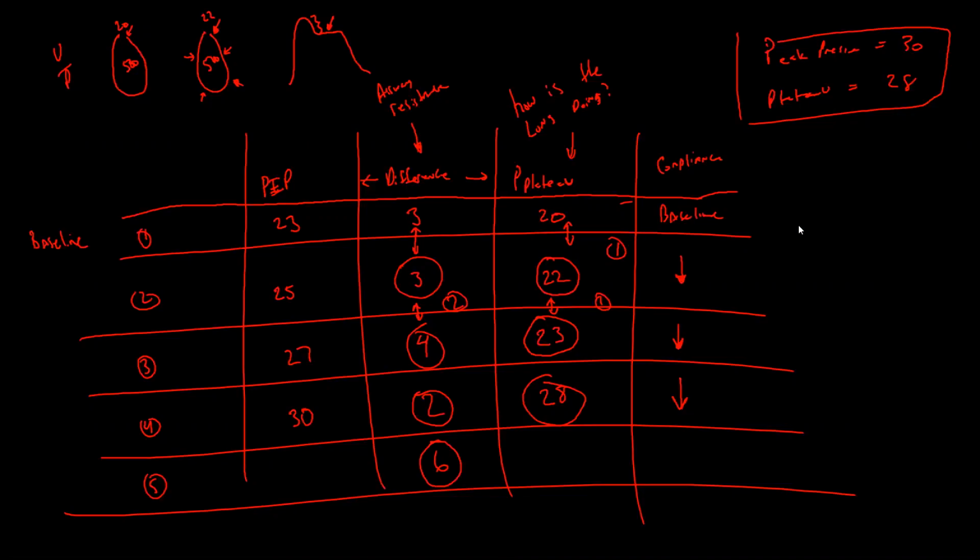Because you'll have one that'll be across the board and it'll say, we did a ventilator check at 8, 9, and 10, and these are the numbers that we came up with. How's the patient doing? And then you'll have answer A, B, C, or D. But then they'll also put it in a form where you'll have a chart and it'll have all the different lung compliances.